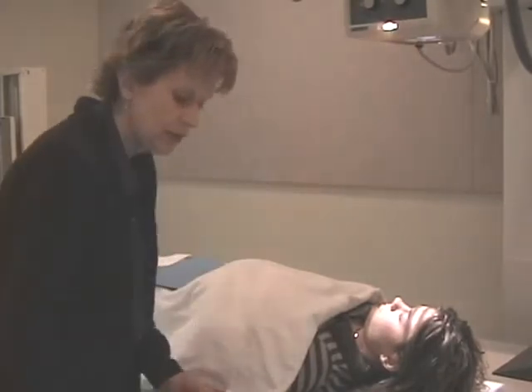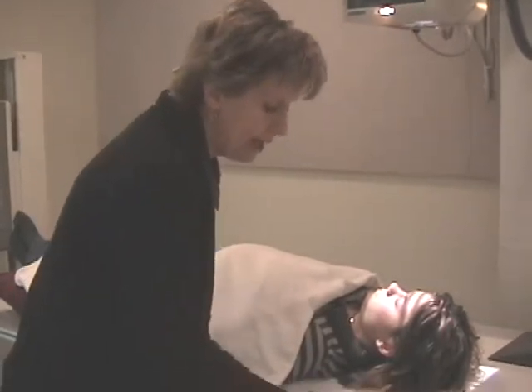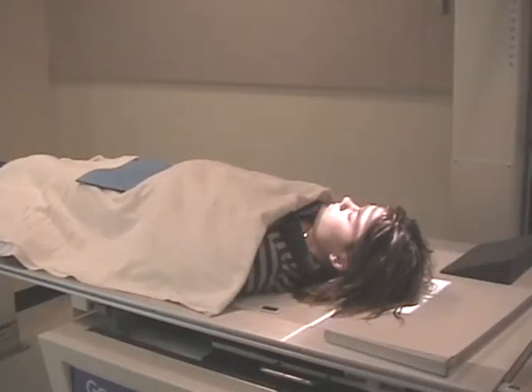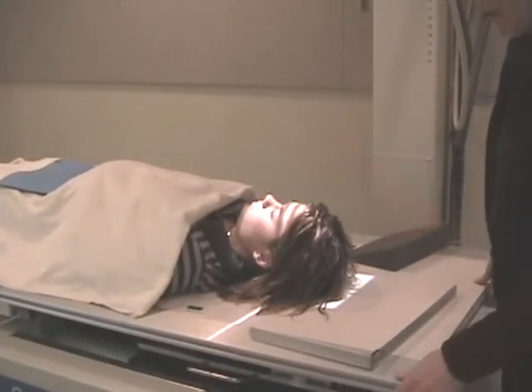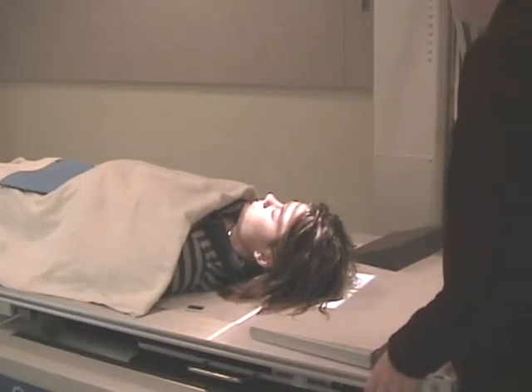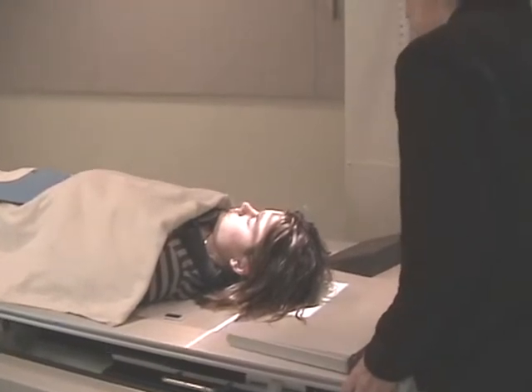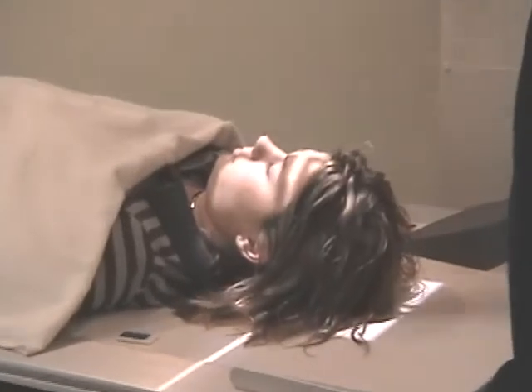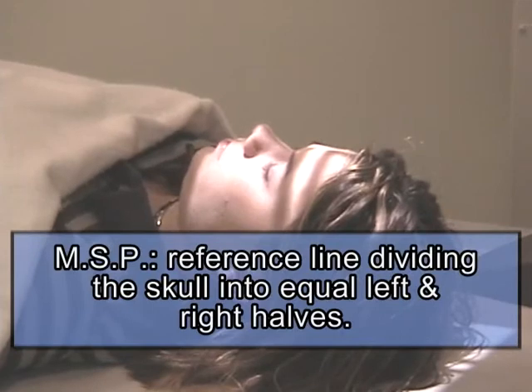Okay. I'm going to switch my position here for just a minute. I'm going to push the cassette in because everything's lined up. Again, the tube is transversely centered to the center of the film. And I'm going to come to this end of the table. And I've got to have our MSP to the center of the table. MSP stands for mid-sagittal plane. And basically what that is, it's the reference line dividing the skull into equal left and right halves.